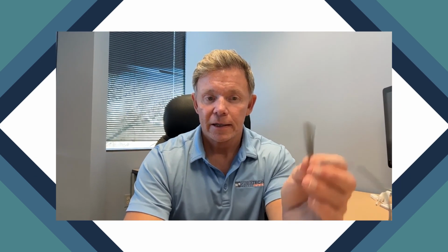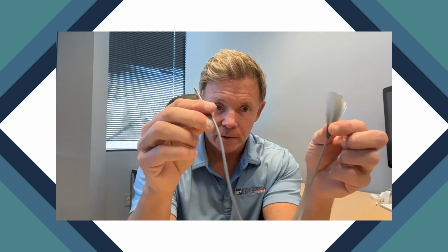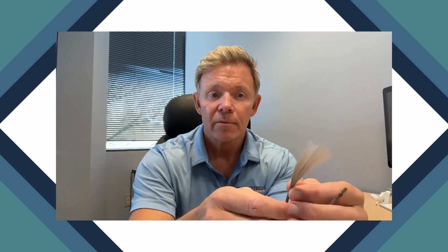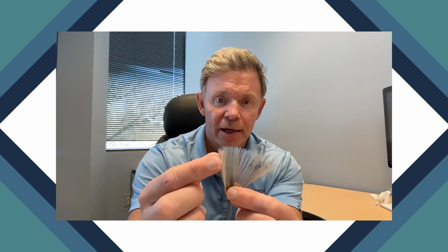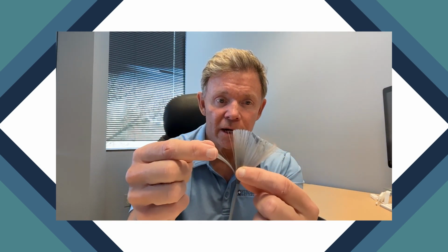Yeah, absolutely. And then here is actually the fiber optic bundle we were just talking about. Okay, so you can see how these fibers are wound together inside this bundle. But when you look at the end and you cut it off, all of these are individual glass hairs. Okay, and if there's a break in one hair, keep in mind this bundle is now 12 feet long because the insertion tube is 6 foot and the U cord that connects behind the scope back to the processor is another 6 foot. So this is 12 foot long. So each glass strand here is a solid connection from one end to the other end.